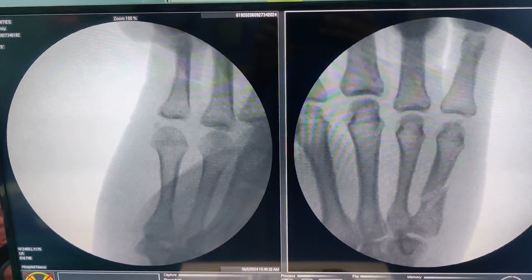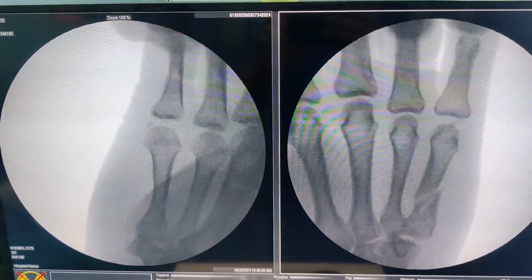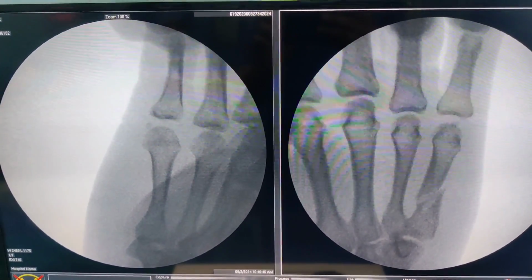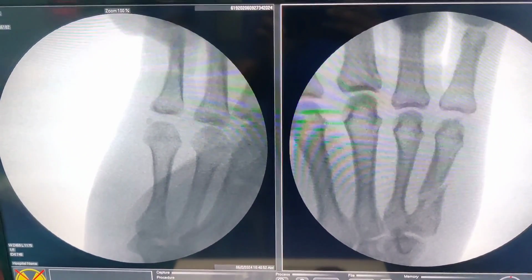Now if you look at the AP view, you can still see the fracture line, but that's absolutely fine. All you need is to gain the length and alignment, and there should be no rotational deformity. While taking oblique, it looks perfectly reduced. So in this position, I'm happy and I just need to pass a few wires.